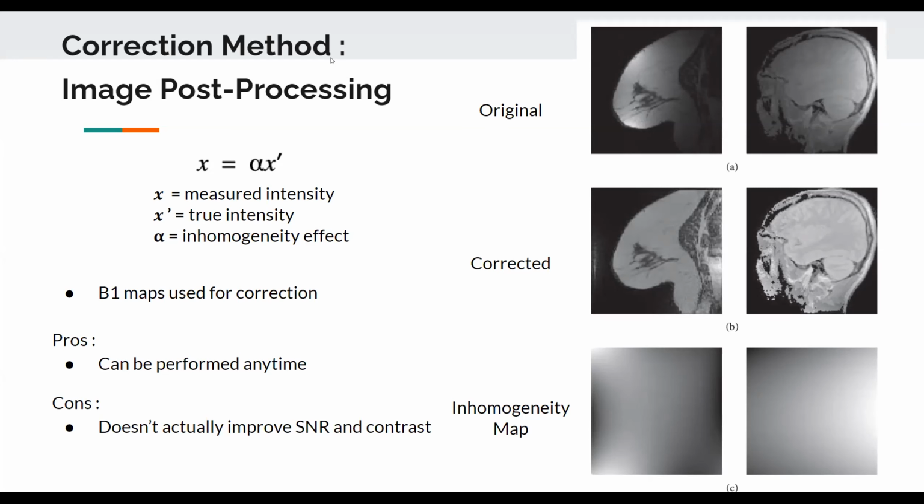Yeah, I think you're right, Mickey. There's a lot of different techniques, and I think for the inversion recovery pulse, there are pre-saturation pulses that can be used as well that we didn't really get into here. But yeah, I think one of our main points is that it depends on what kind of application you need and what your requirements are for them. Absolutely.